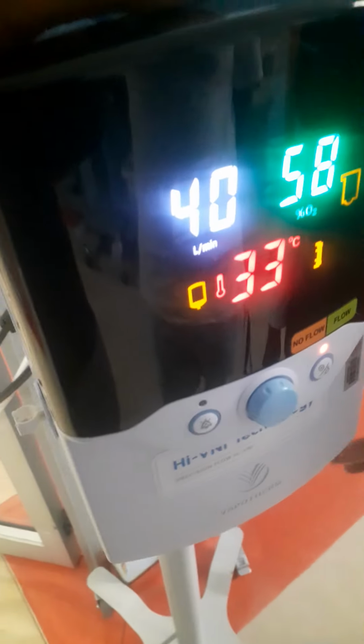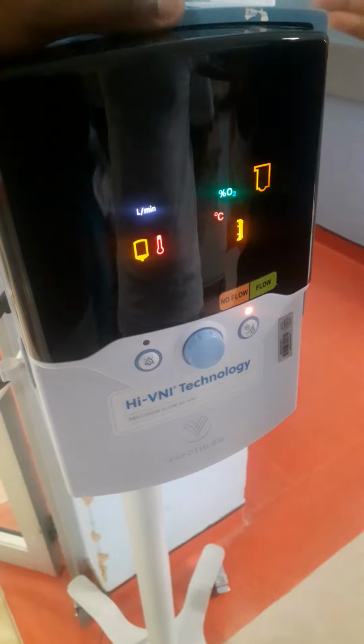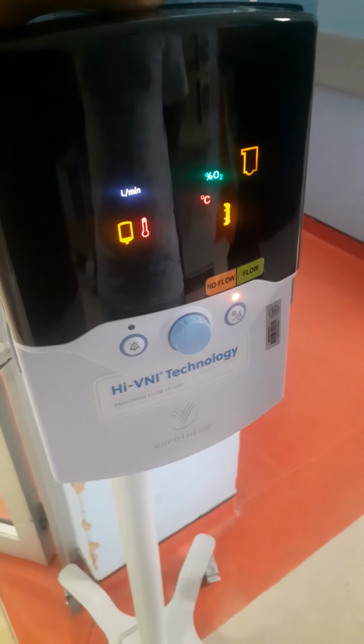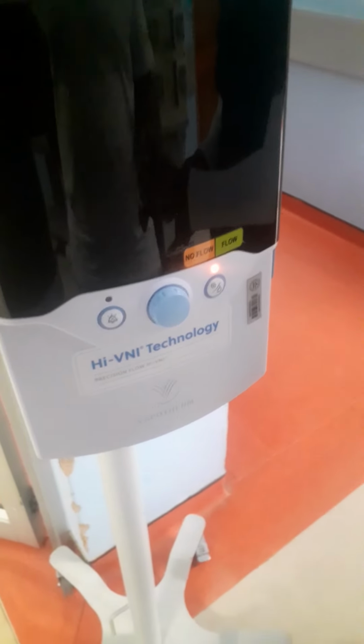So the advantage of this one is the humidification and the higher flow, because it's like when you are watering your garden, with the hose, you close it there. Again, when you point it down, it will dig. So that's just higher flow, that's what it's describing. What will happen when it comes in there? It will just flush out everything that is in the way, and it's warm. Then it will get loosened, and then you will just blow your nose.